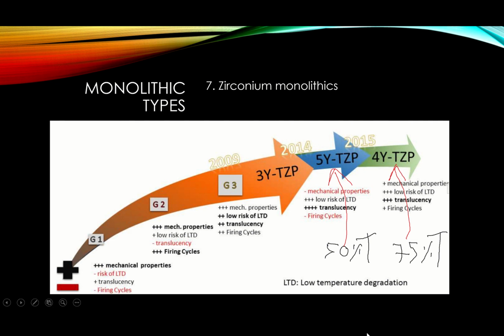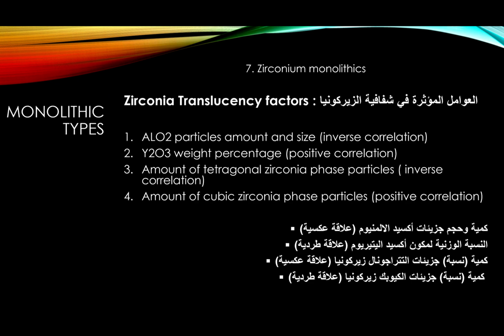This is what I want to talk about, strength in relation to tetragonal. More tetragonal stronger, less tetragonal weaker. All right, and then let's now move to the translucency factors. We talked about the strength factors. Now we're going to talk about translucency factors.